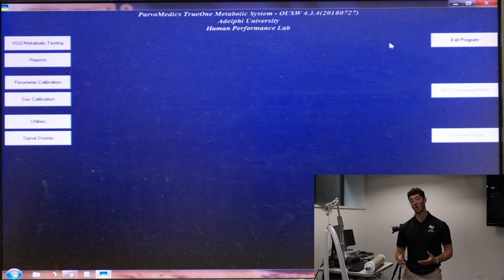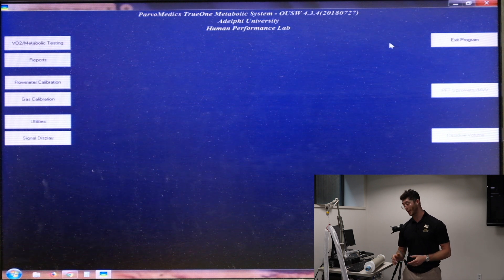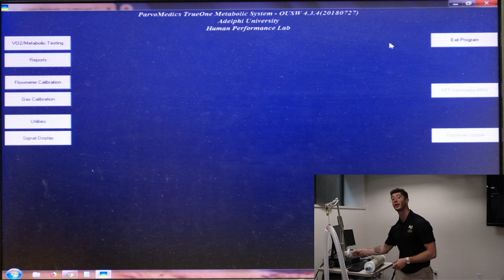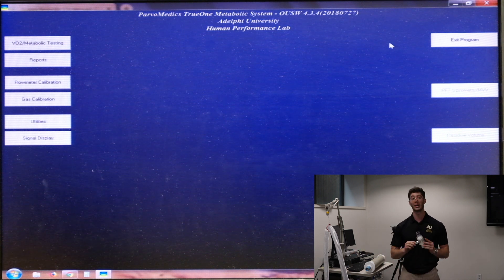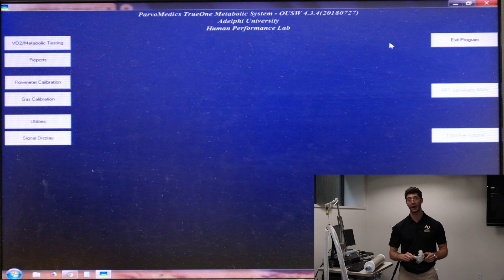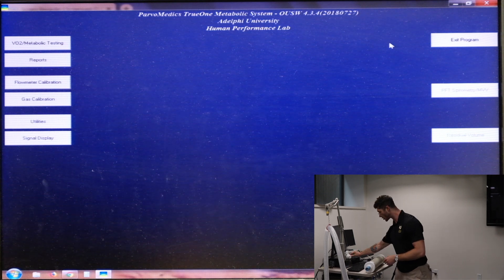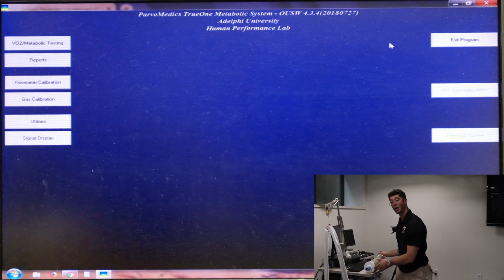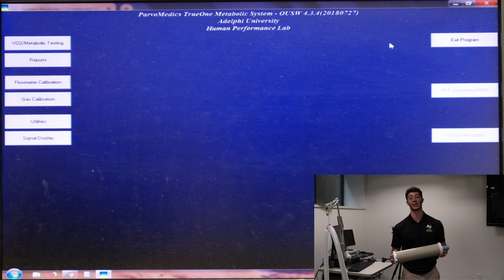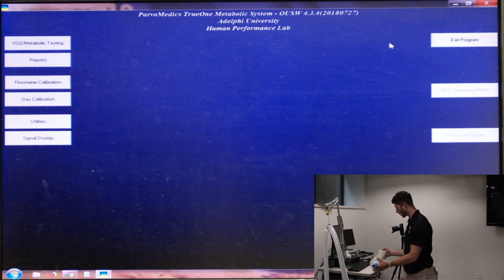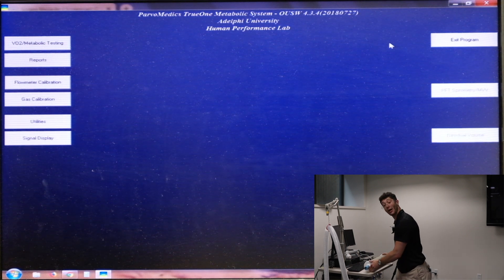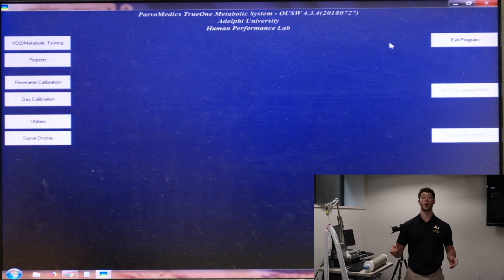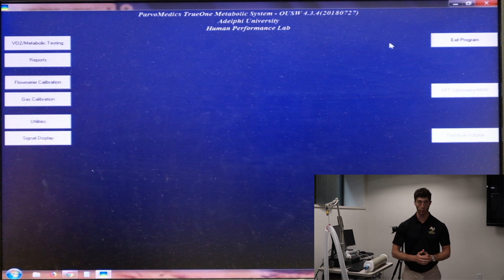In order to start our calibration process we need a couple more things. We need an assembled mouthpiece and we also need a three liter calibration syringe. So once we've got those things we are ready to go.